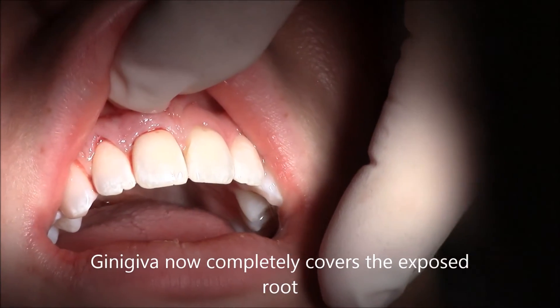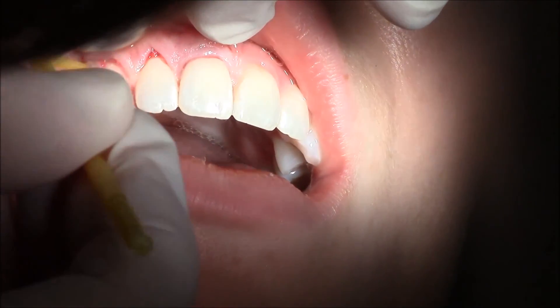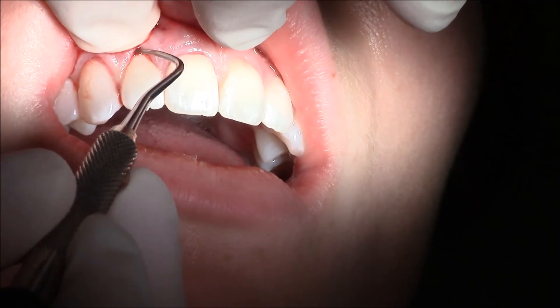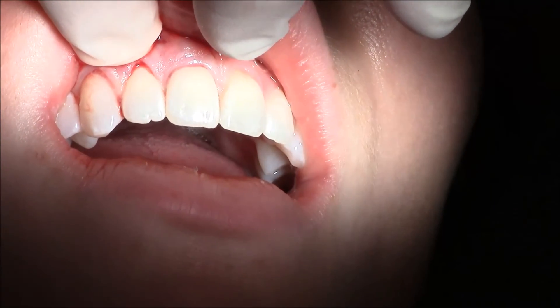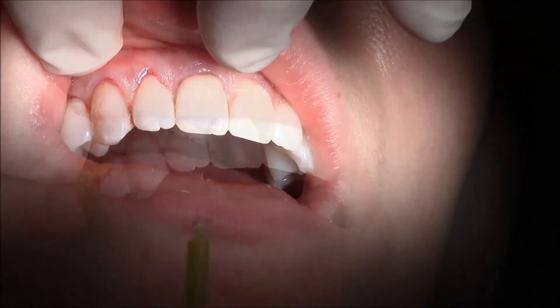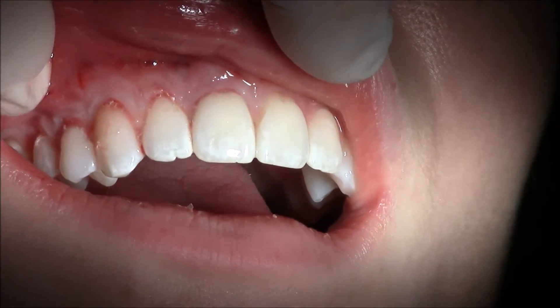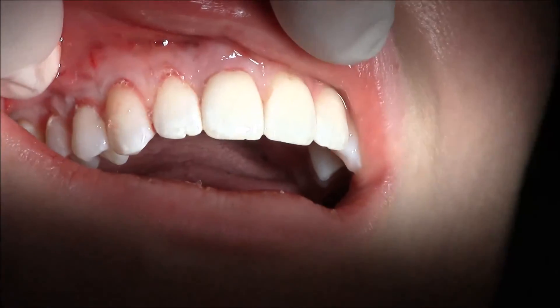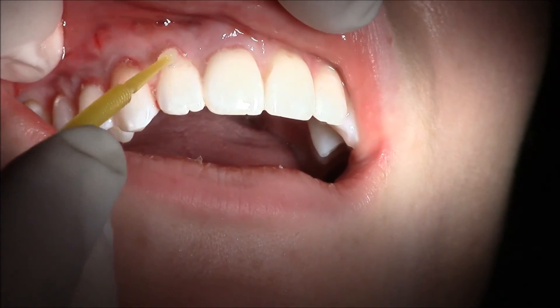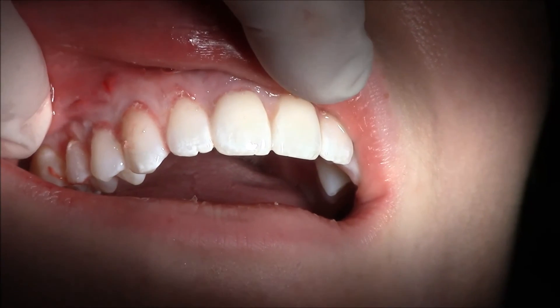That's nice and thick, back to normal. We can go in and make sure everything is looking good aesthetically, which is of course not the main reason we did this — it was to prevent severe issues later. Then we use a surgical adhesive, the same surgical adhesive that would be used in the operating room, to attach the tissue and seal it so bacteria can't crawl into the graft area. See how nice it all looks, and there's no bleeding. After we put on the surgical adhesive, we then apply the Sevrotec Plus.